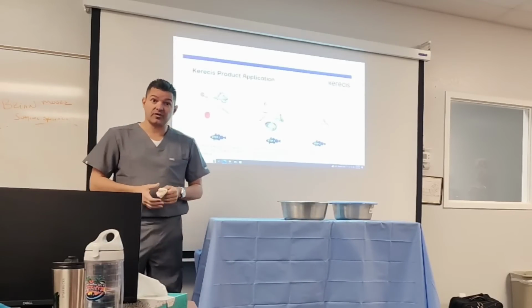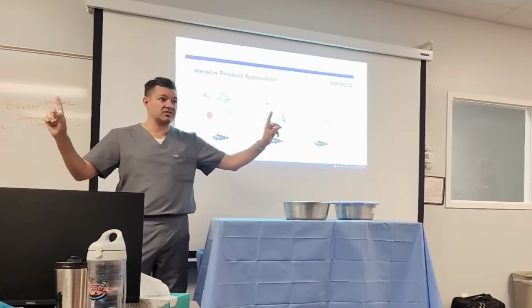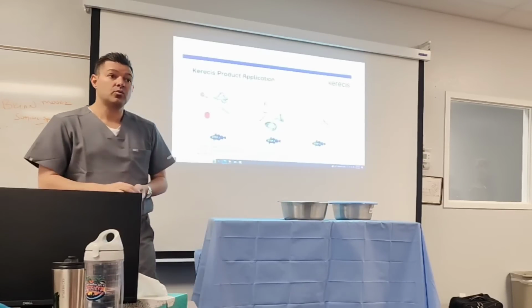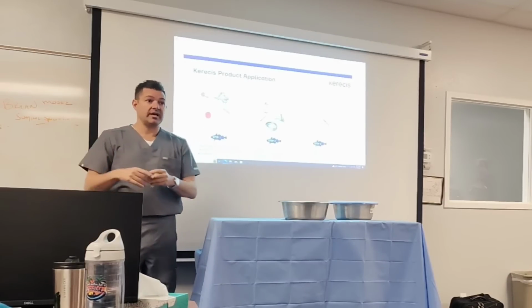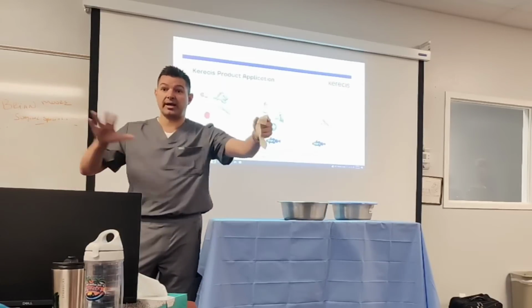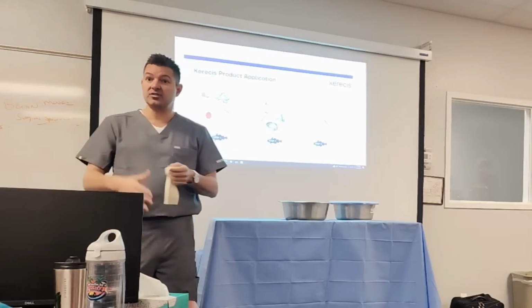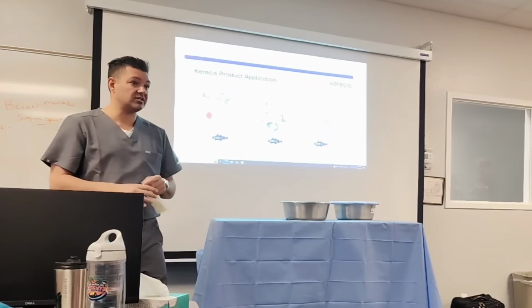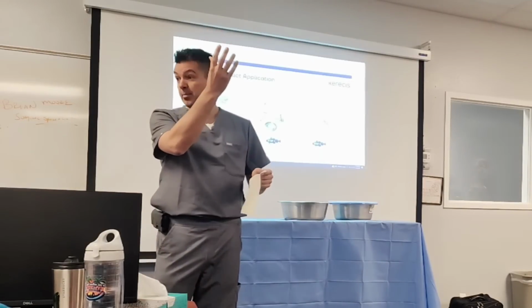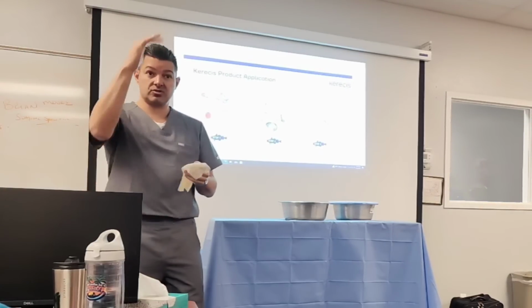In a burn setting, for example, it's completely different. It's all about the post-op care. So I thought I'd give you 2 vastly different experiences. I just shared with you the wound setting. Now in the burn setting, the patient is laying in a certain anatomical position. We usually apply a meshed area because it gives greater coverage. Again, it's physician's preference based off what that particular patient is experiencing. We also lay this down scale side up, okay? Scale side up, because of the epidermis and the dermis layer of the structure.